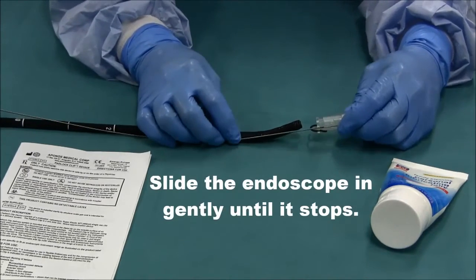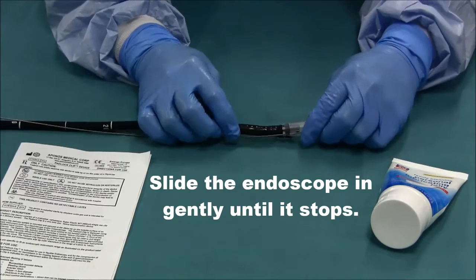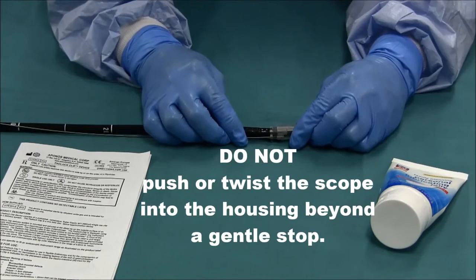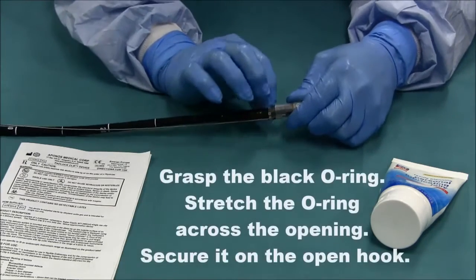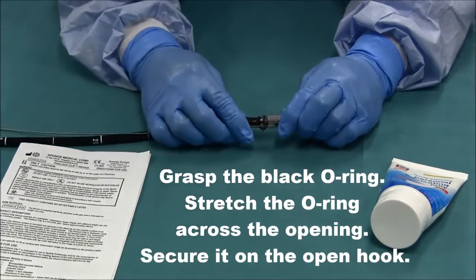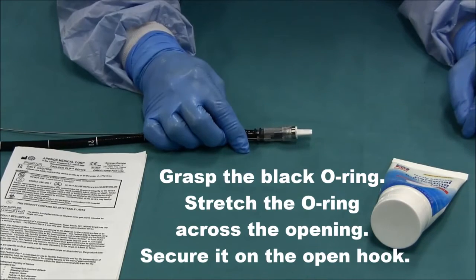Slide the endoscope in gently until it stops. Do not push or twist the scope into the housing beyond a gentle stop. Grasp the black O-ring, stretch the O-ring across the opening, and secure it on the open hook.